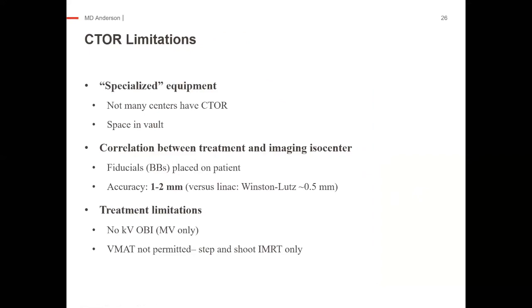But there are some limitations to CT on rails, as with all things. It is specialized equipment, so not many centers have this available, and it also takes up a lot of space in the vault. So it's not like you can just renovate an existing vault, because there probably isn't room to add a CT scanner.